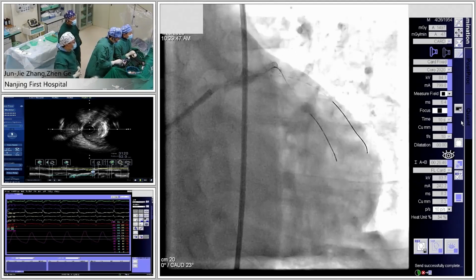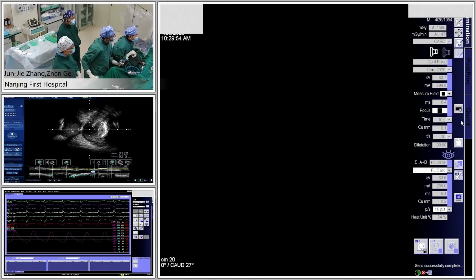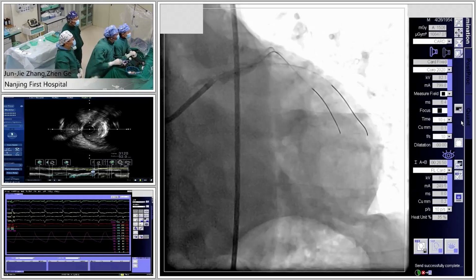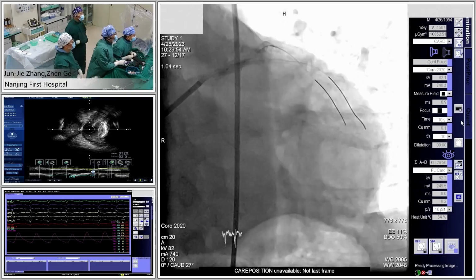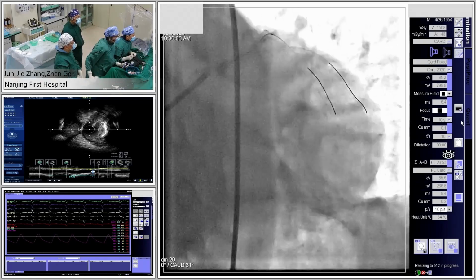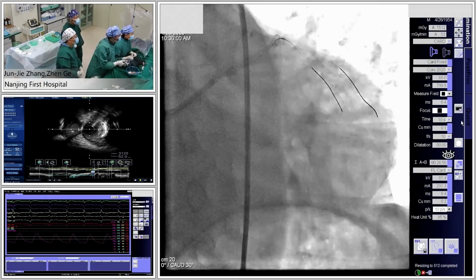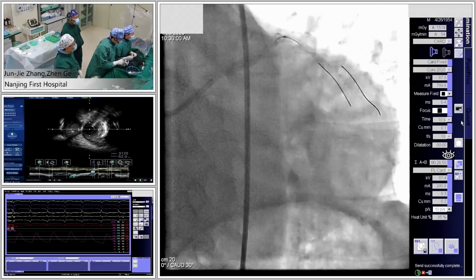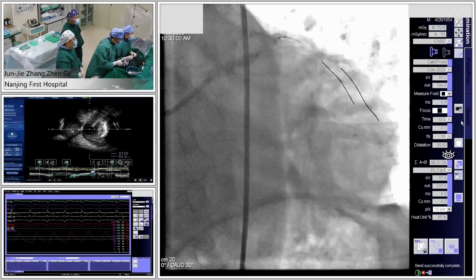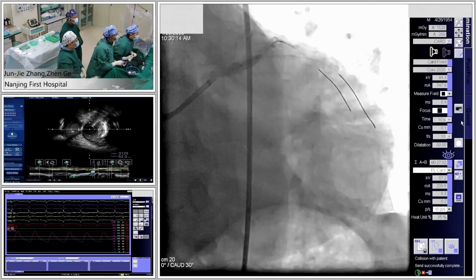Do you think we need more distal, Dr. Ge? Okay. Yeah, it's good. Be careful.